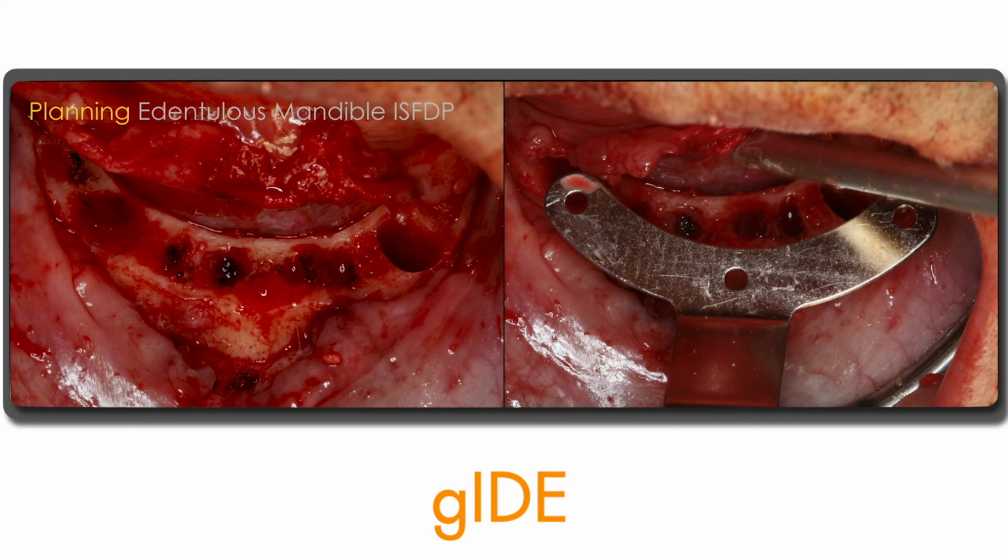So this is trefoil, so this is not Novum. So this was carried out probably 3 years ago now. And here in this mandible, the teeth were extracted, alveolectomy was performed on the ridge.